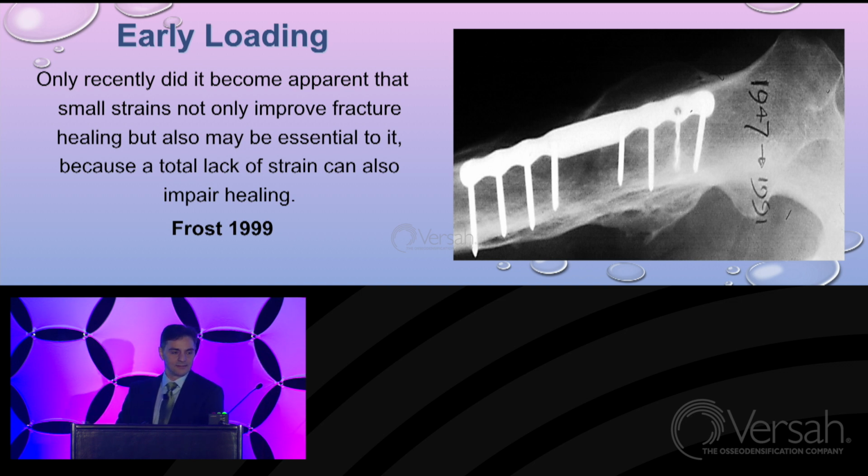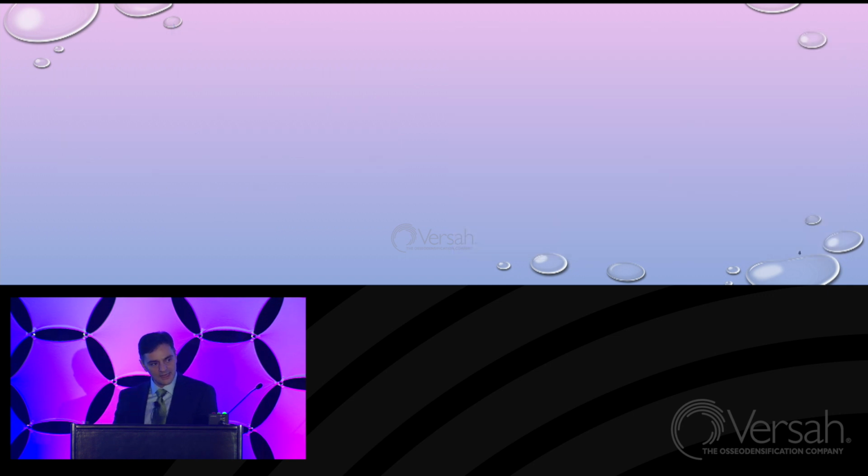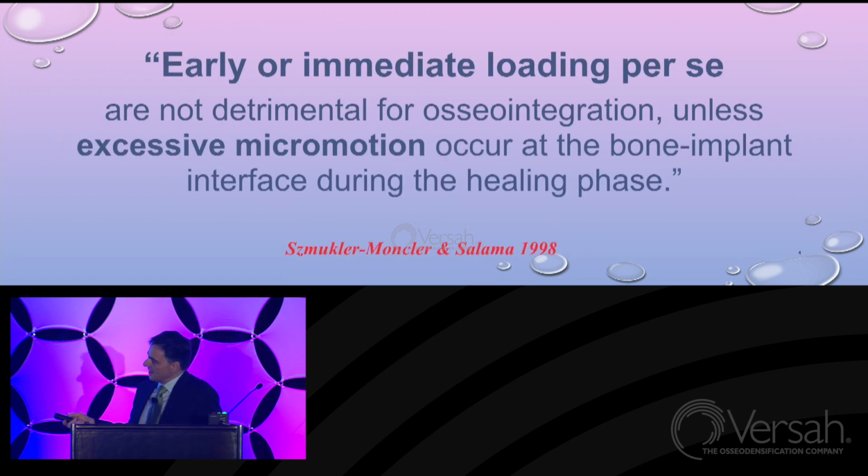Like this screwed plate, it takes the load off the shaft of the bone and induces bone loss, which is lack of strain. So it was in the second half of the 90s that we started to understand that immediate loading is not a problem. It's not the loading that is the problem by itself, but the micromotion at the interface between the implant and the bone. Micromotion at the interface.